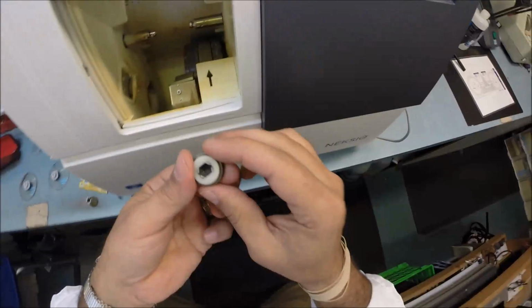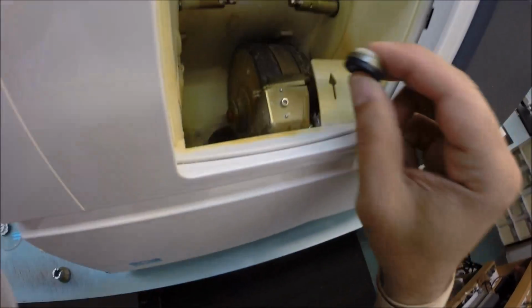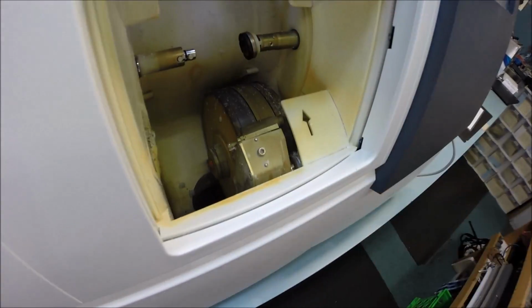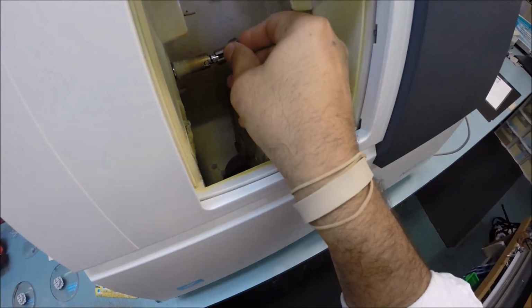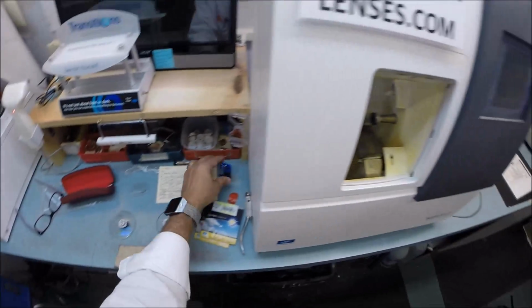So let's get rid of this thing. Let's put this one on. Again, that's the little piece, the little rubber stopper. That's going to stick on that side. And then the Charles, the Chucky baby, goes on that side. And we're going to put your lens, hang on, let me demonstrate this.